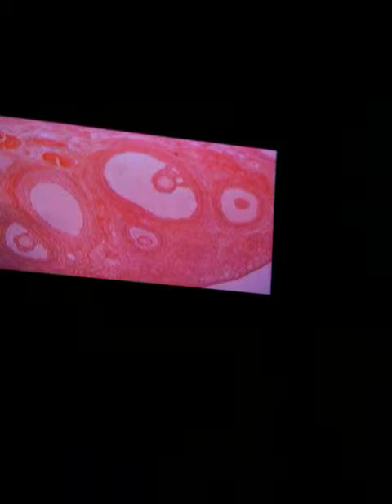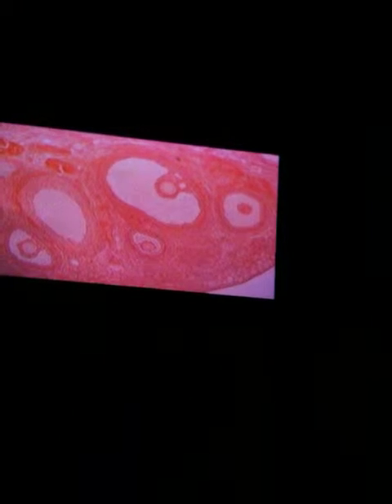There's the oocyte. What about this over here? Is this a primary, secondary, or tertiary? Tertiary. Mature. Commonly referred to as what? Do you remember the word Graafian follicle? You guys remember that? No? Okay. So this is your Graafian follicle or your tertiary. This is the oocyte. There's a corona radiata. This is ready to be expelled one of these days. What about this down here? What's that?